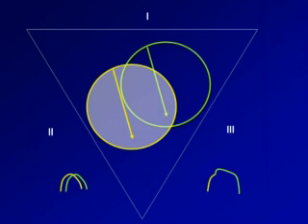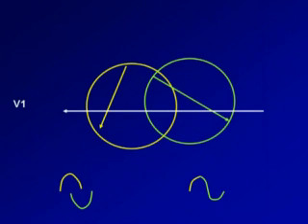So it's normal. Lead 2 is the best lead to see the P waves, and it's normal to see a little bit of notching in the P wave. Now V1 sits right over the right atrium, so it's going to see right atrial depolarization coming out towards it, and with a little bit of delay, the left atrium, which is the most superior and posterior aspect of your heart, depolarizes away from V1, so we may see this sine wave appearance, and that's perfectly normal.